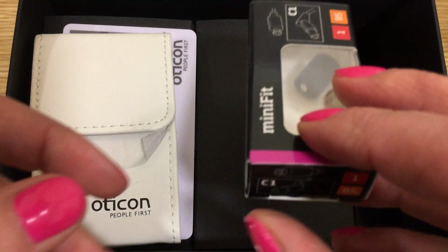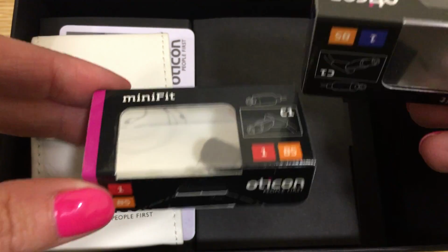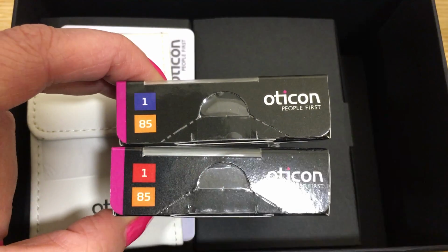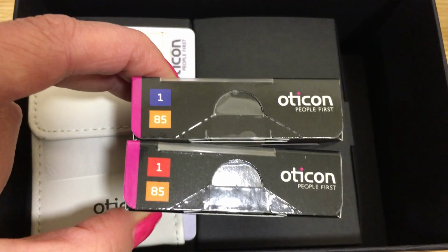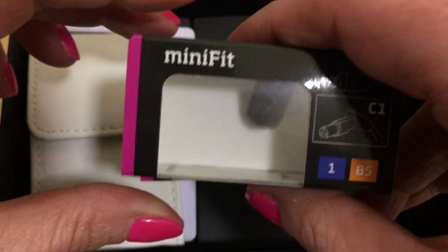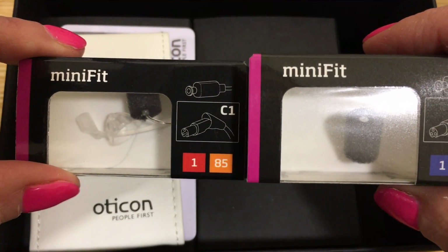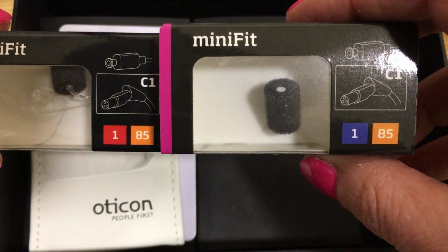Here we have the speakers. These particular speakers are size 1. This indicates the length of the speaker. They start off at size 0 and go up to size 4. Most adults will use a size 2. The red number 1 indicates the right ear, and the blue number 1 indicates the left ear.